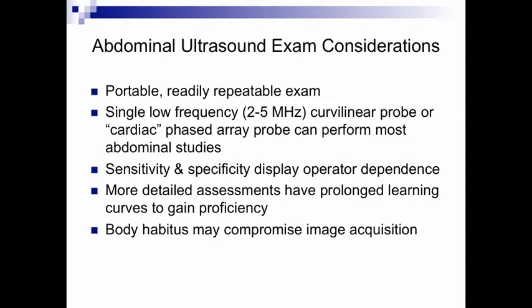But the caveats that apply to abdominal ultrasonography are similar to caveats that apply to pleural ultrasound or echo, that skill acquisition takes time, and the sensitivity and specificity you actually obtain with your examination tends to be operator dependent. Anytime you read any paper that pertains to the use of ultrasound in a bedside clinical setting, you want to ask who was doing the ultrasounds and how many have they done, because the sensitivity and specificity findings that they'll report will be widely variant depending on who was doing the exams and how much training they'd had.